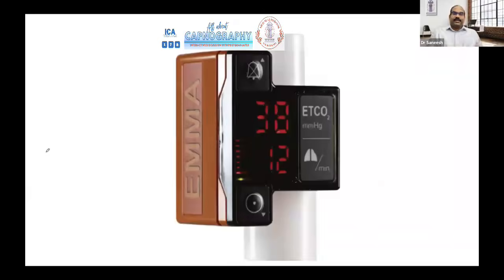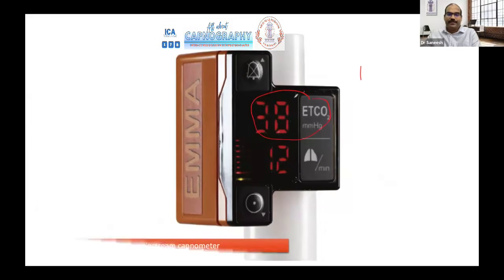Okay, who is going to identify this for me? The equipment shown here. We'll start in alphabetical order. Dr. Aditya, have you seen this equipment? Yes, sir. Is this a capnometer? Capnometer, because it gives only the value. It's not giving the tracing, and the equipment is called a capnometer. Okay, fine. This is the Emma CapnoCheck mainstream capnometer.